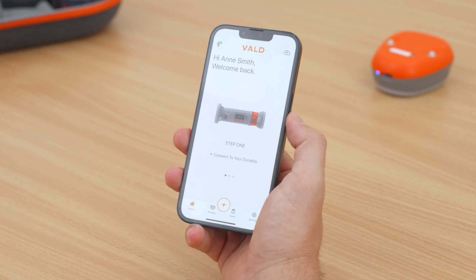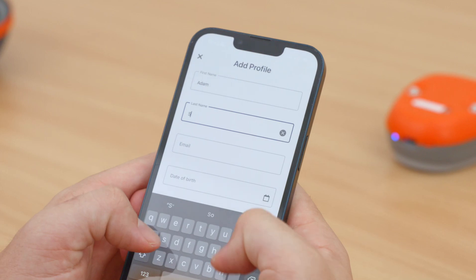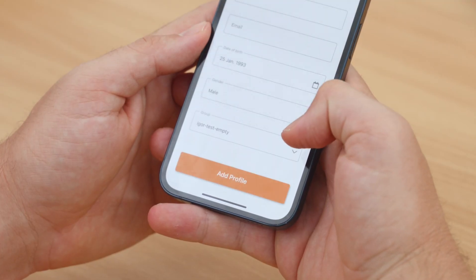You'll then be returned to the home screen. Now you can create a profile for your patient or athlete by entering their details and clicking Add Profile.